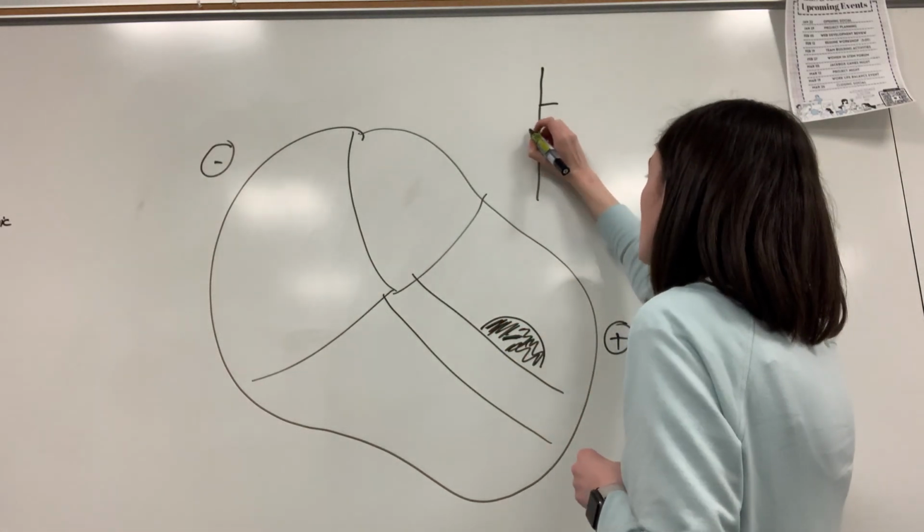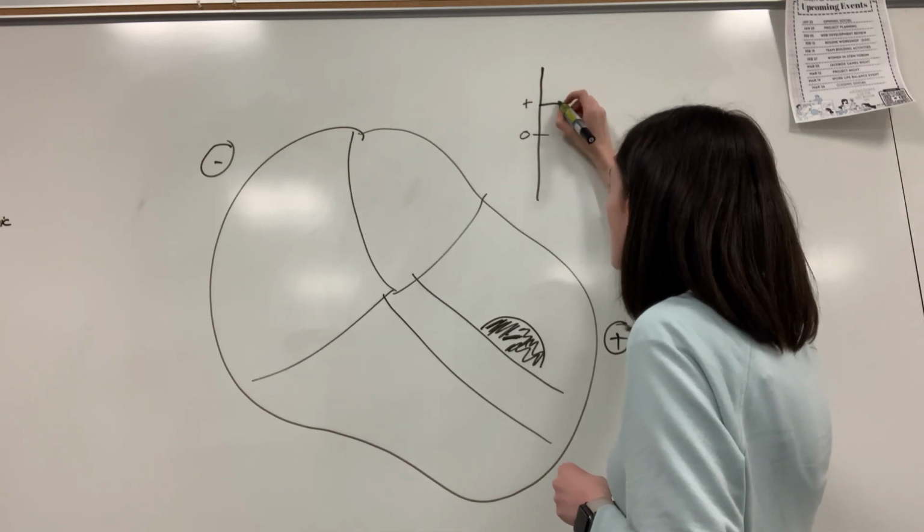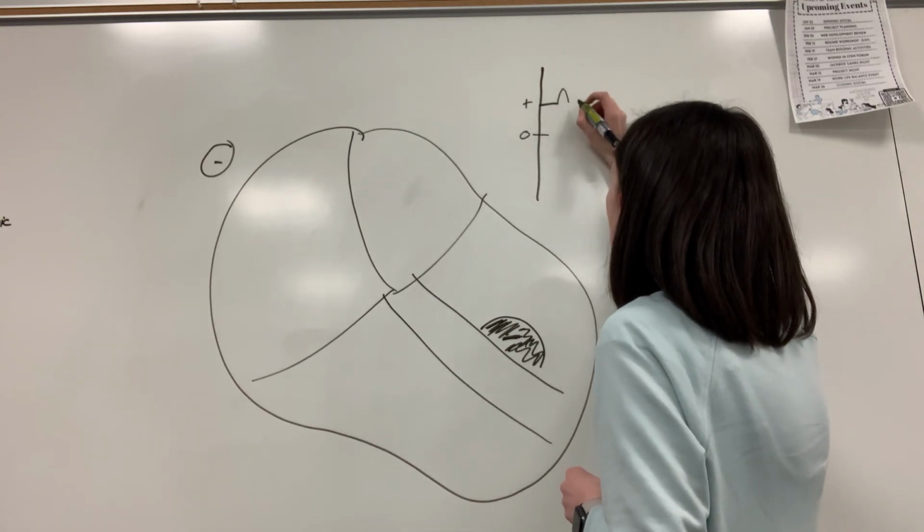So say this is our normal level. Now our EKG level is raised up here.